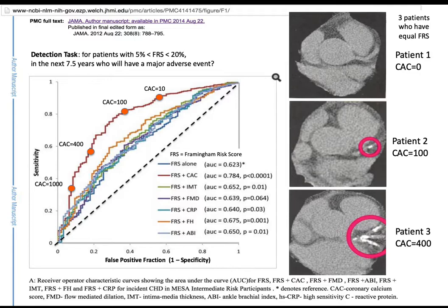This is again a slide that he showed, where you can see on the patient on the top the difference between your fatty tissue, which is the dark gray here, and your myocardium relative to your blood pool. Even though you haven't injected any bright contrast agent here, so the vessels are kind of hard to see, if you have calcium, you can see that it is this really bright signal.